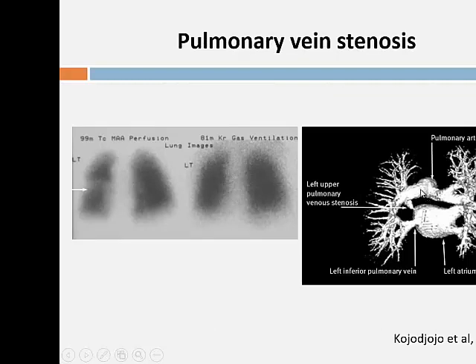You can also look for pulmonary vein stenosis. The important thing about pulmonary vein stenosis is it can actually mimic pulmonary emboli. So patients can present with breathlessness. You can do a VQ study, and that actually shows you a perfusion defect on the VQ, and that's a manifestation of the problem with the pulmonary veins. So when you do an MRA, you can follow it with a second phase and just do an MRV. So you get that for free, and you can look at the pulmonary veins.